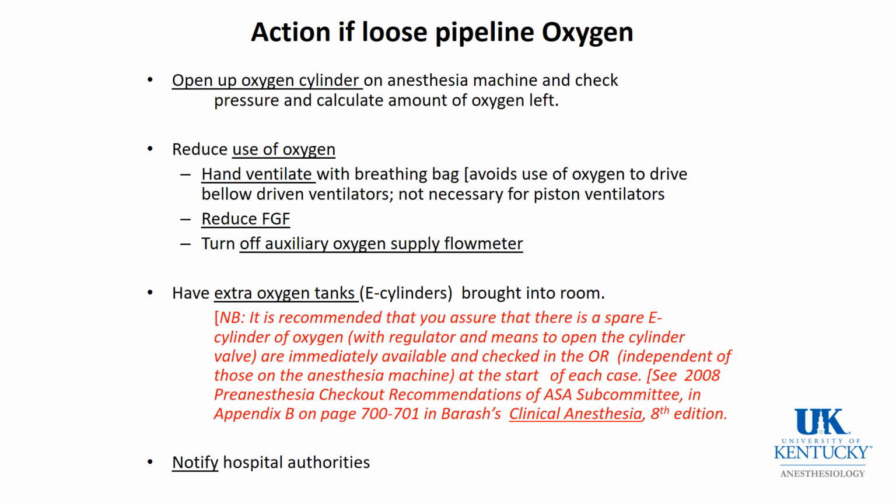By the way, this is part of the ASA clinical checklist. Before you start a case every day, you should make sure there's an extra E-cylinder in the room so that if the one on your machine wears out, you have a spare. And finally, notify people that you have a problem.